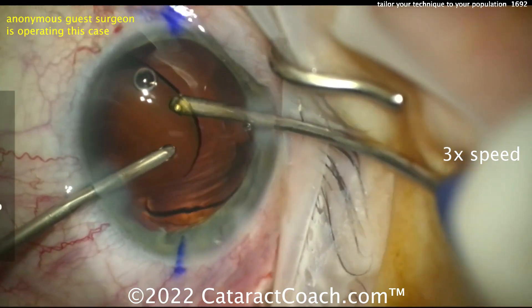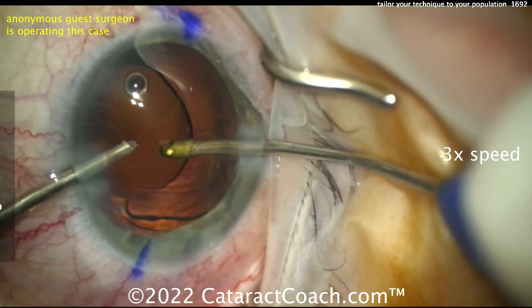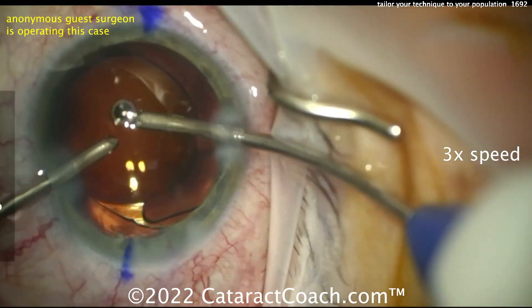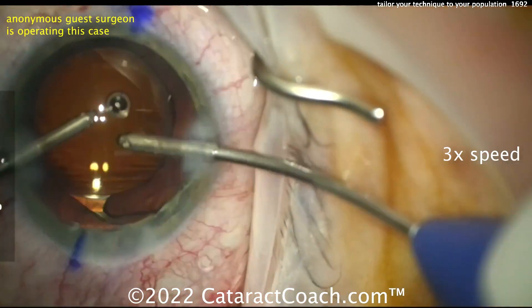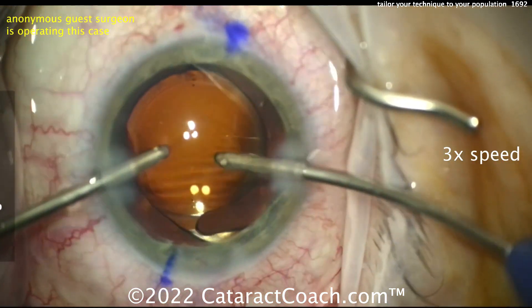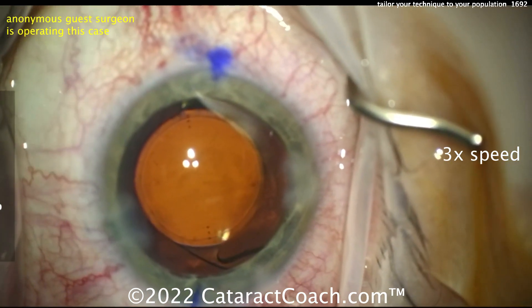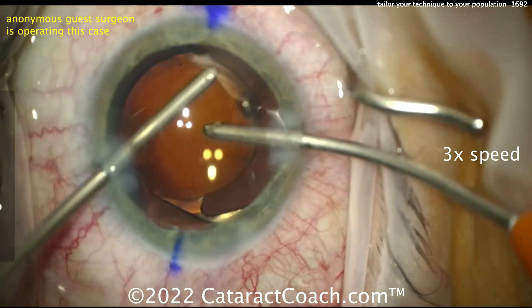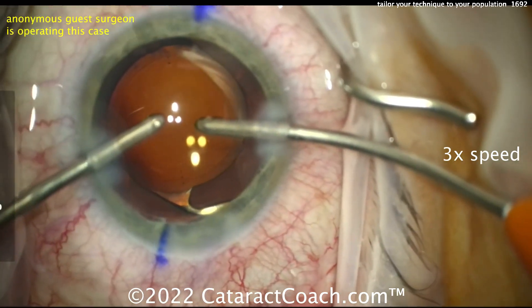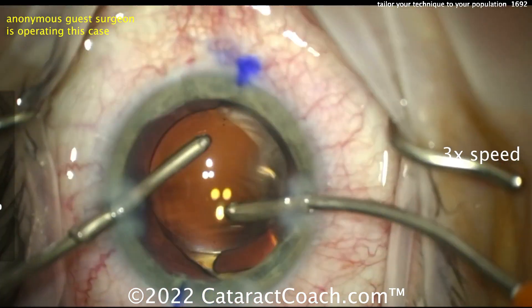When you watch these Cataract Coach videos, ask yourself: what do I normally see in my own clinic, and how should I tailor my technique to my patient population? If you have absolutely brunescent rocks, you better run that MSICS procedure — small incision manual extraction is a magic trick. But if you have patients like in this video with 2-plus NS, flip and chop is like magic. Get that nucleus out of the bag, get a quick chop going in, and you're done.